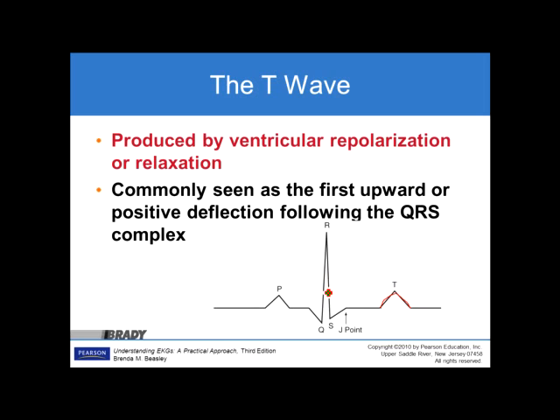If we remember back from the previous slides, this right here, from whenever the Q wave occurs till halfway through the T wave, is the absolute refractory period. And anything after that, from halfway through the T wave to the end of it, is the partial refractory period. Now, if there is enough stimulus in that half section, where the T wave has almost all repolarized, we could form something like VTAC or VFib. This is called an R-on-T phenomenon.